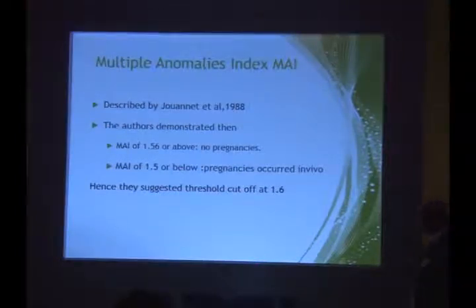Now, why is morphology important? Let me tell you that the ability of sperm to fertilize, I told you, cannot be predicted by count and motility. So we have only one parameter in the semen which has direct linkage to the fertilizing ability of the sperm. In other words, if your morphologically abnormal sperms are very high, the fertilizing potential of this semen sample is very poor, no matter what the count and motility are. That's the take-home message.